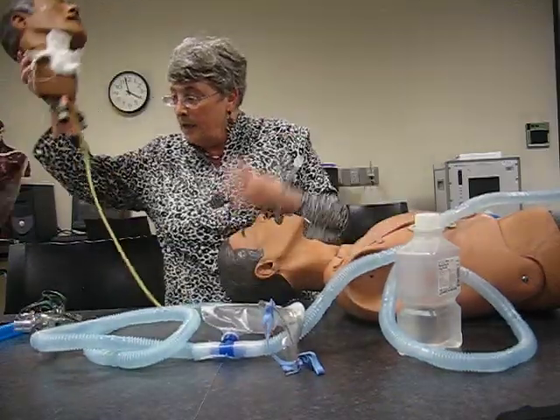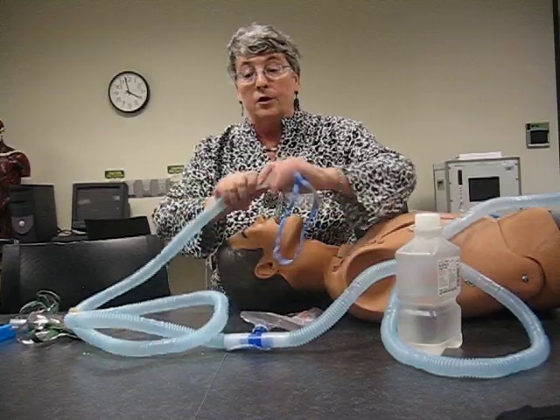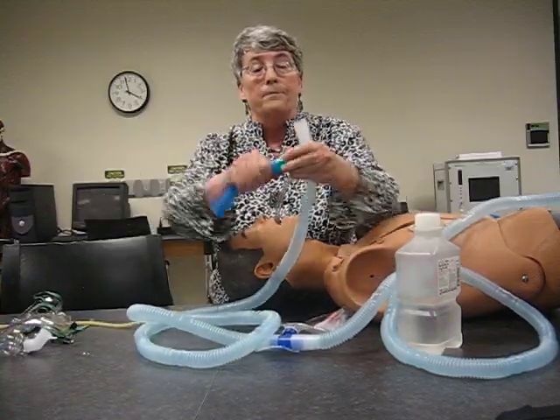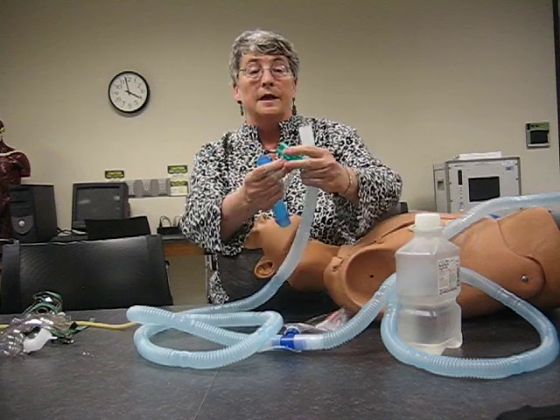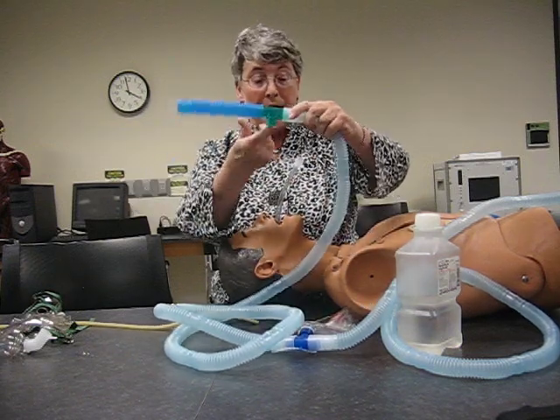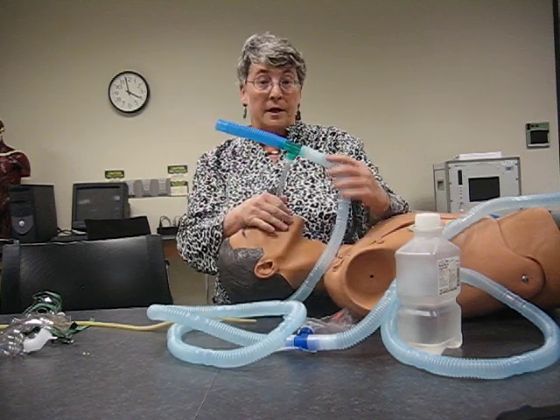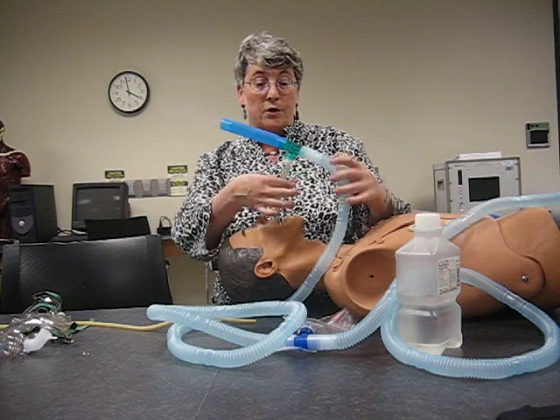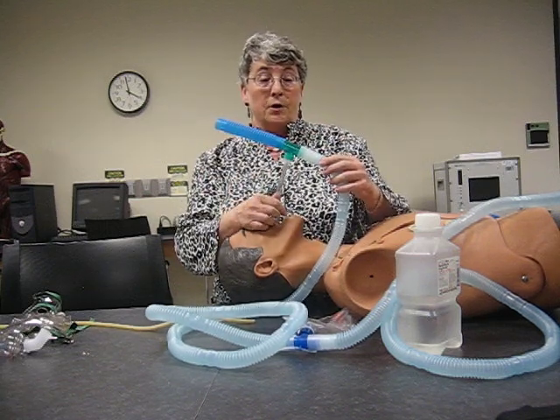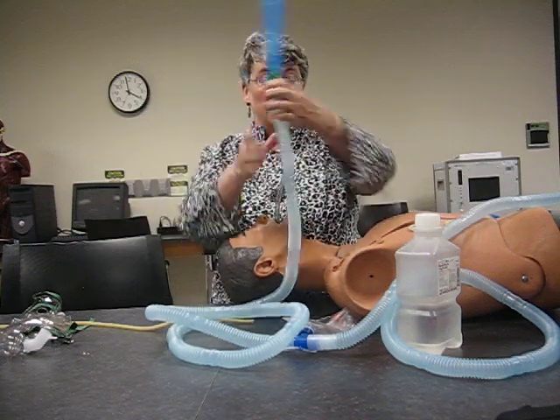Now we're going to move over here, and I'm going to demonstrate the ET tube T-piece. This is a T tube — it's shaped like a T. On the bar we have the two hoses, and the one that goes down goes to the patient. When he's breathing, you can see the mist disappear. This is the ET tube, this is the T tube adapter, and this is his reservoir. If you put it like this, he doesn't get as much oxygen — so we attach it correctly.